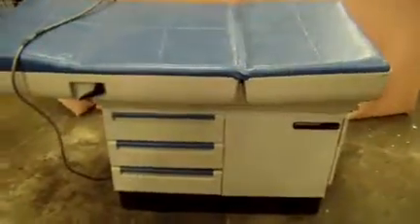It's DCSP Medical on the warehouse again, looking at a mid-mark 404 exam table.